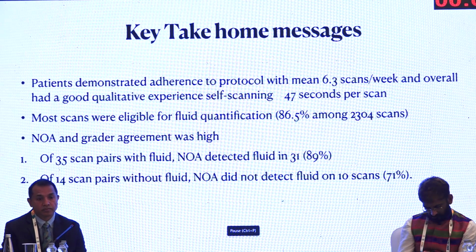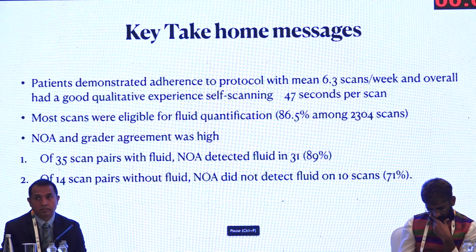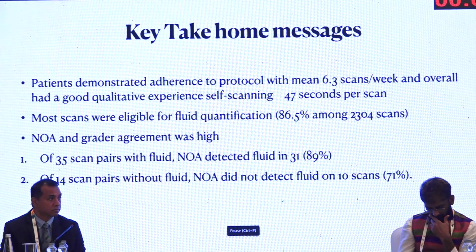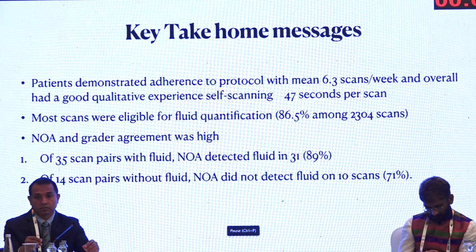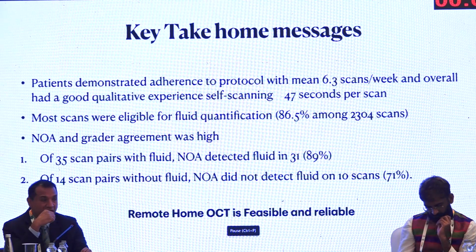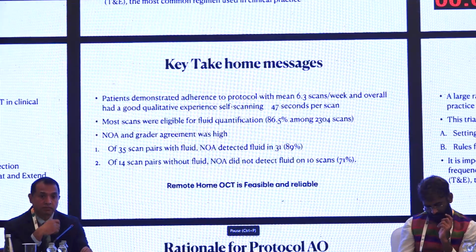And if you look into the grader agreement with the Notal OCT Analyzer, the agreement was pretty high. You can see nearly 89% of the time the NOA detected fluid where there was really fluid, and when there was no fluid, 71% of the time it could say that there is no fluid. This study showed that the remote home OCT is feasible and it is also reliable.